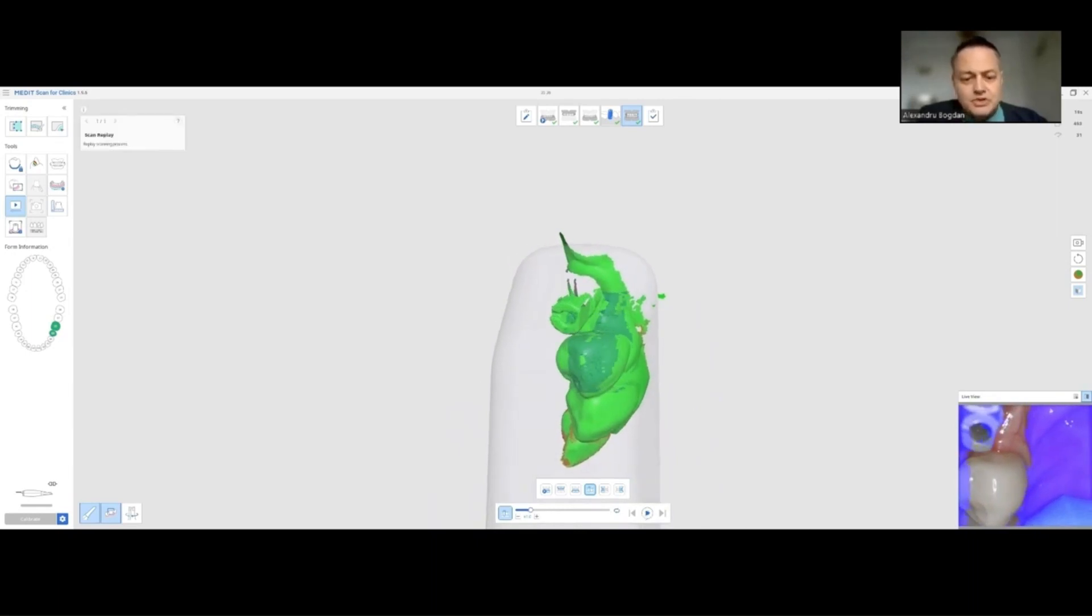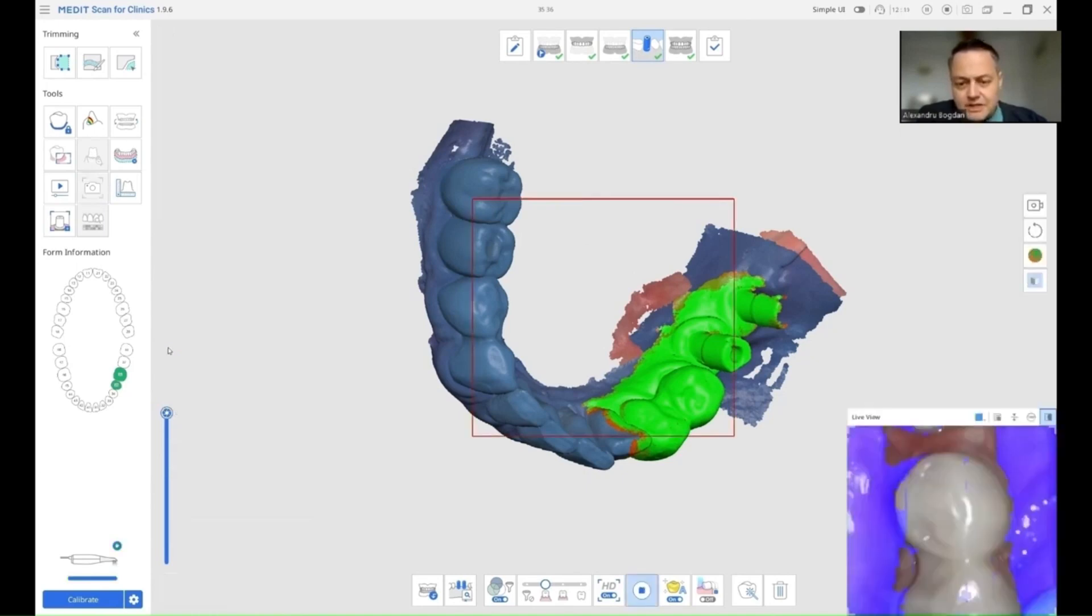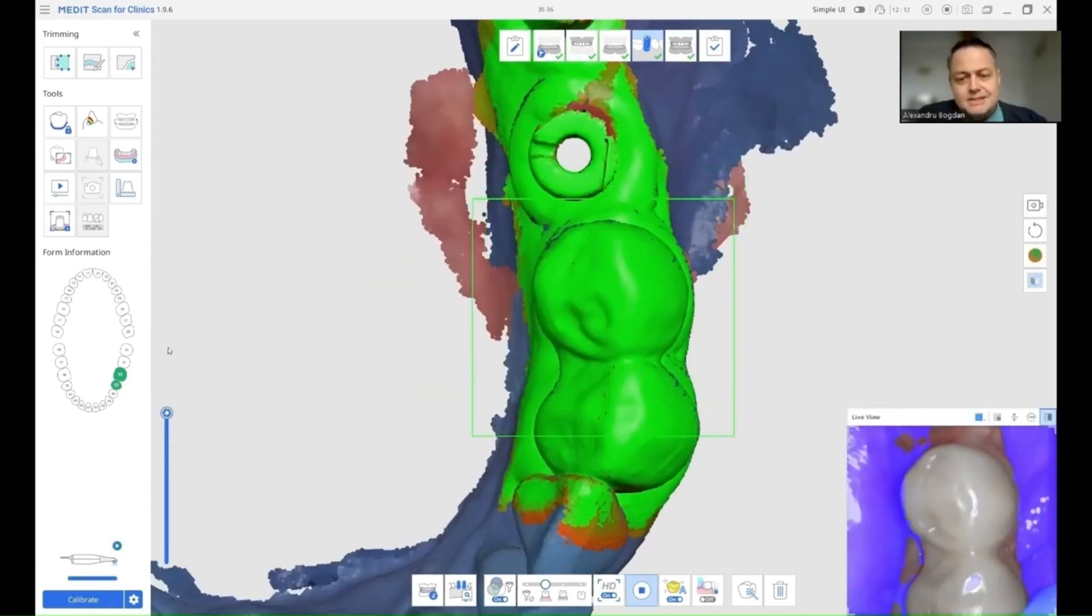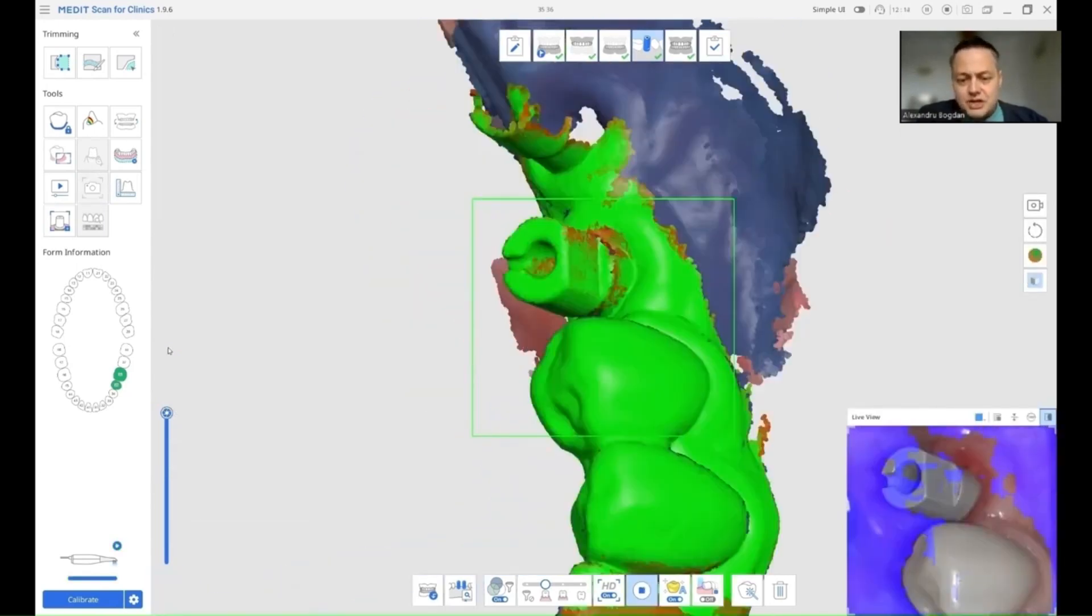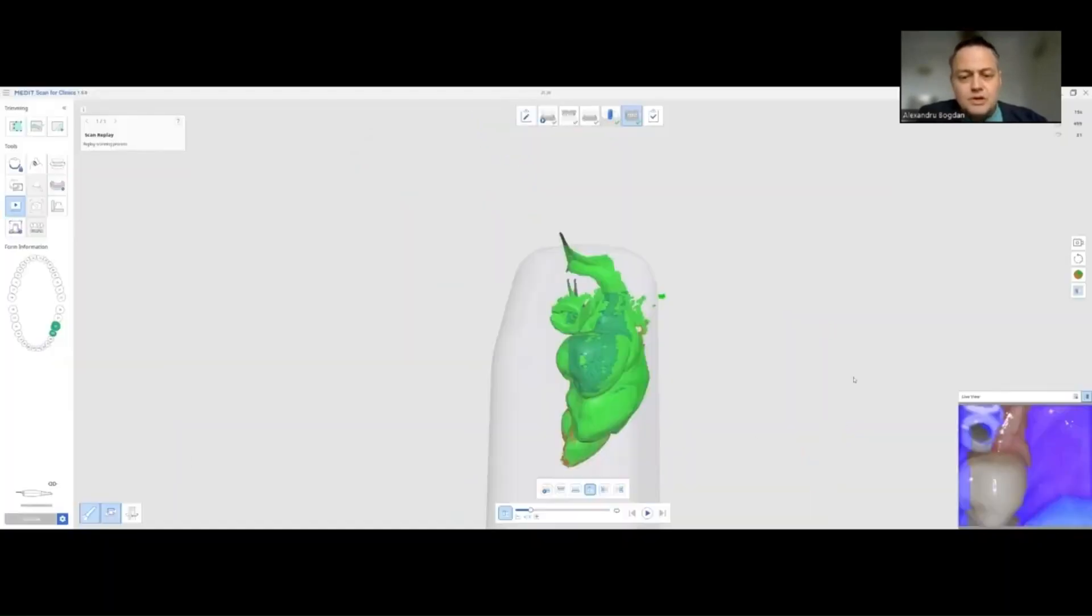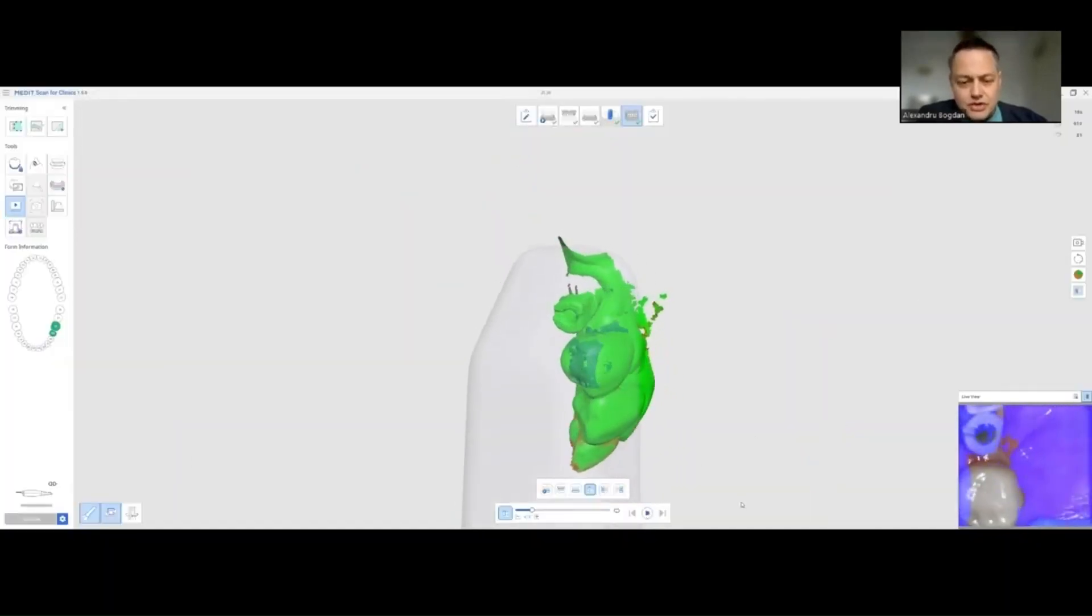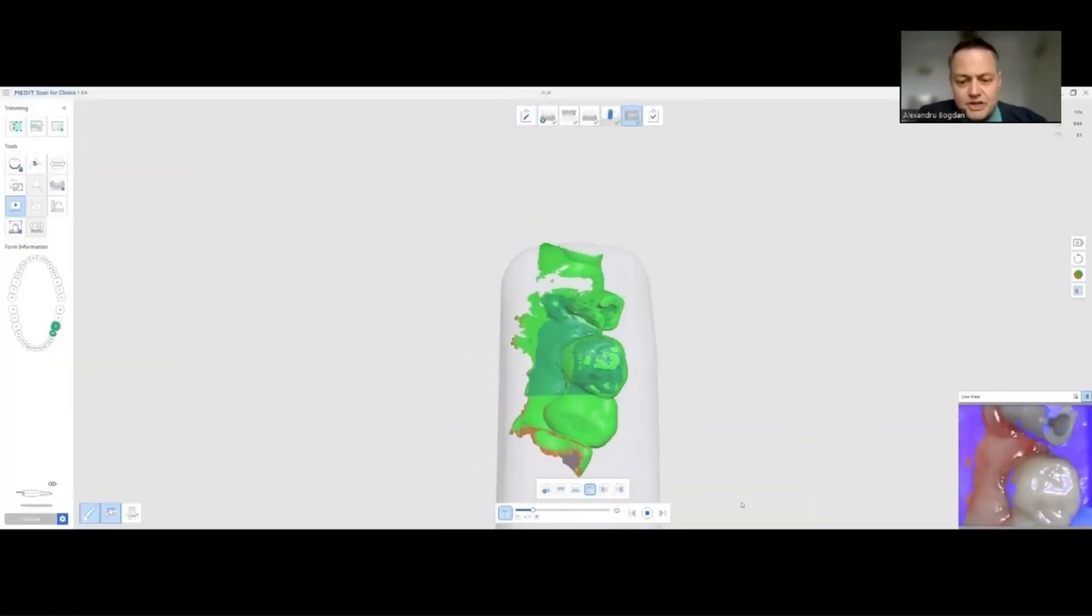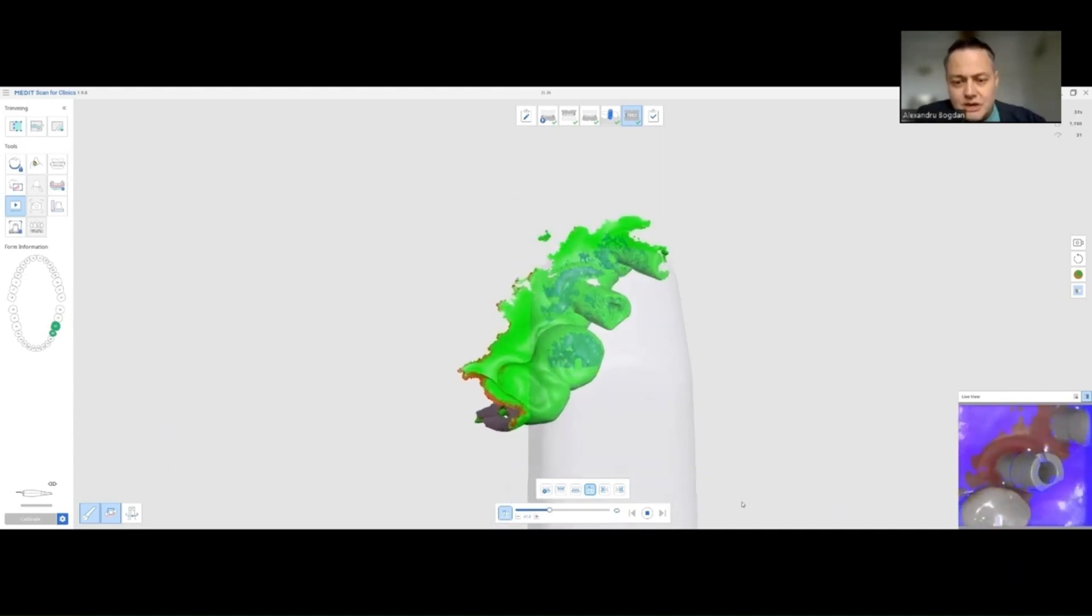Why we do this? Because the scan of the scan bodies is a different mesh and is going to be superimposed on the working arch. On the operation stage, we start by scanning teeth.